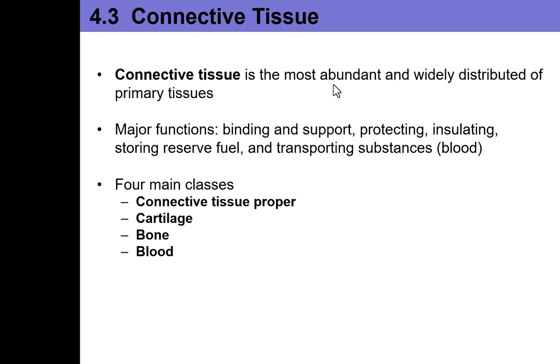Hello, everybody. I'm Dr. Cairns, and this is going to be a relatively short lecture about the types of connective tissues, a little bit of information about what they do, but mostly how to identify them under the microscope.